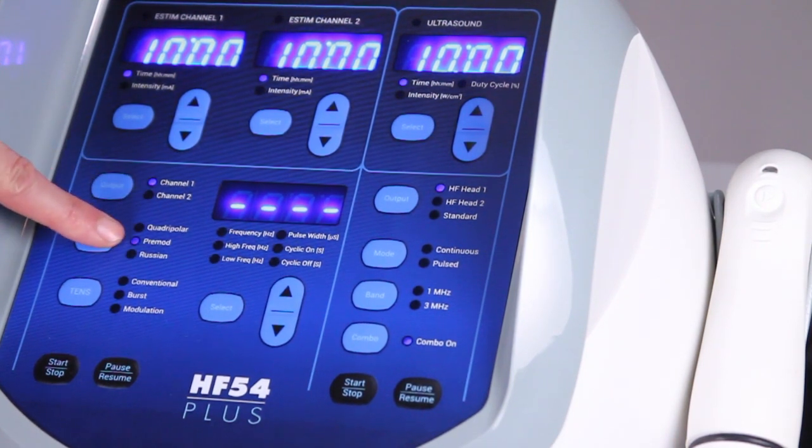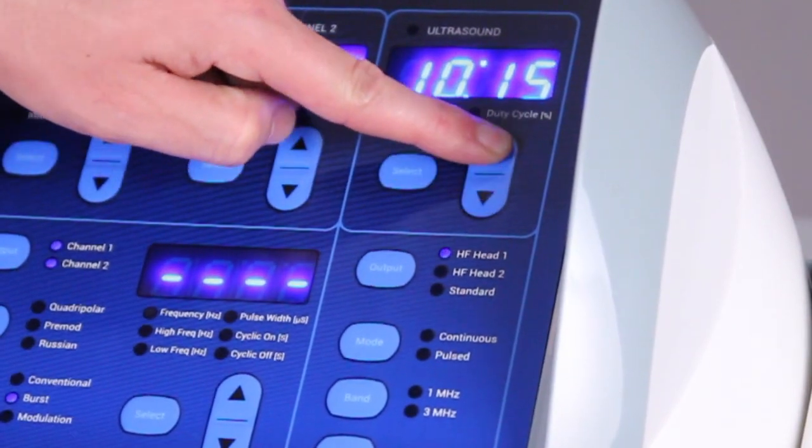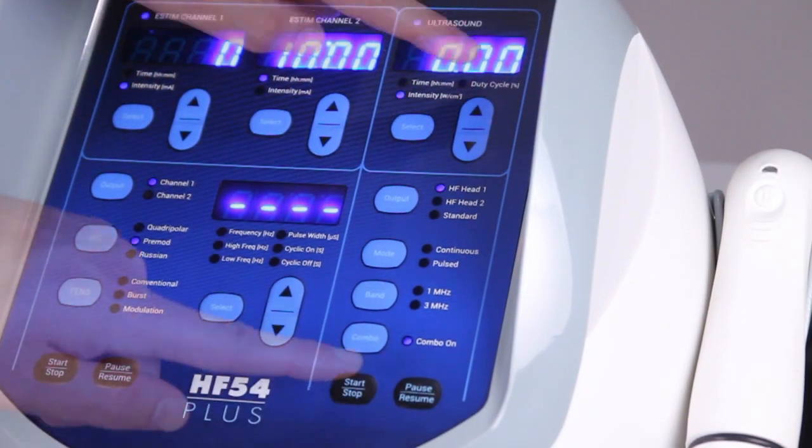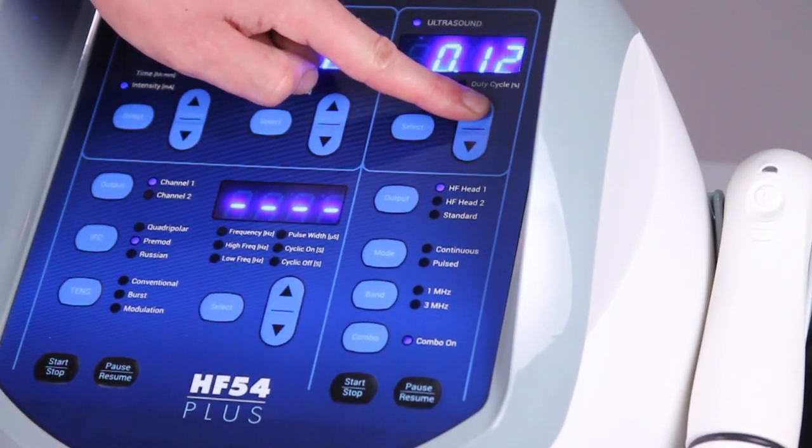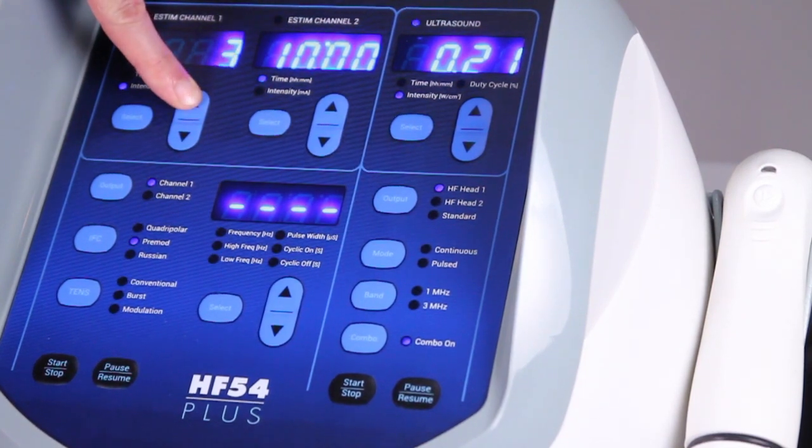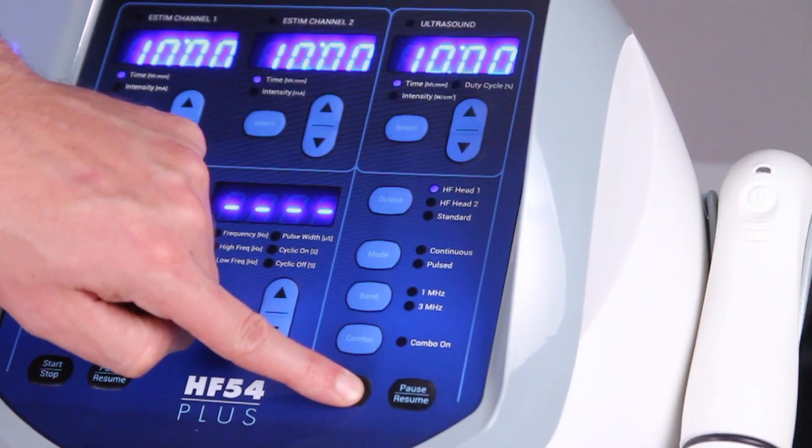E-stim channel one will light up with pre mod already selected. Set your time with either the ultrasound or the e-stim channel arrows and press start. Press the start stop button at any time to stop the treatment.